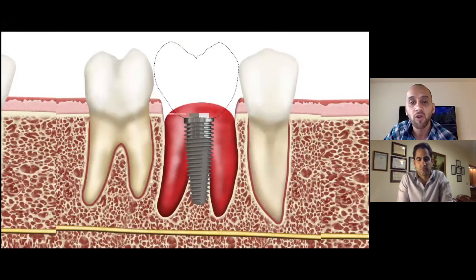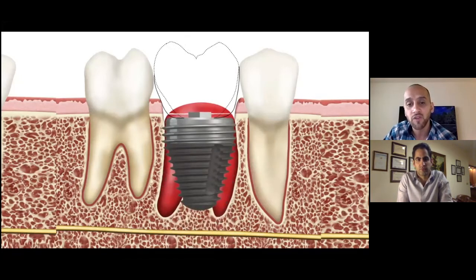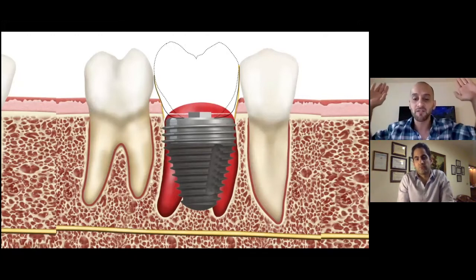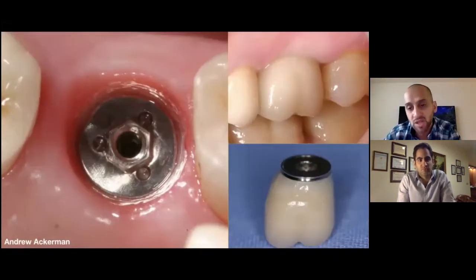So if you place a 4 or even a wider implant, that gives you the ability to have the right emergence profile. So nowadays, for immediate loading, we even place these wider diameter fixtures called molar replacement fixtures, called the Max implants. And this is a separate lecture that maybe you and I can do a webinar on later. But they have really changed the ability, because now you don't have to worry about coming out and up. You can just directly come out of the fixture and close off these embrasure spaces.